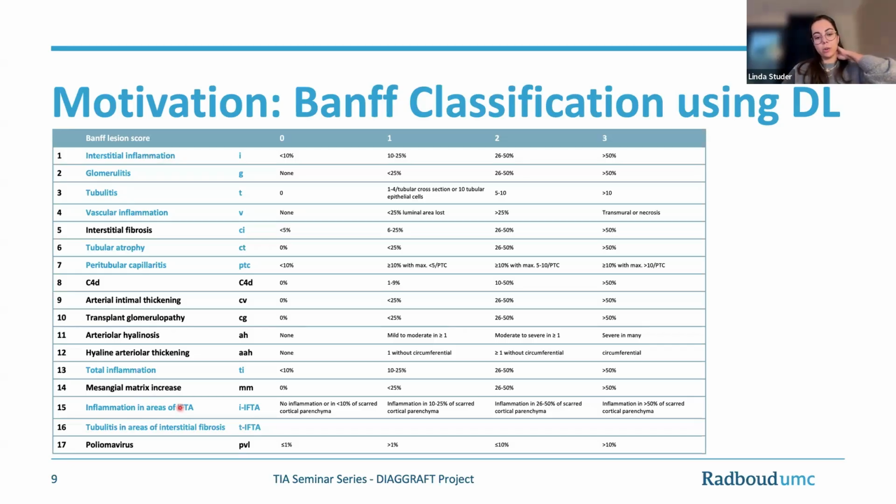So what we're working on now: we're not really looking at automating any of the other things, except maybe having a combined segmentation model and not these two separate ones. We're rather looking at seeing how it could work in diagnostics. But what we also want to do, and we're definitely working on it for the paper on the reader study, is to have an automatically computed Banff score. So we are working on getting the individual objects and being able to count the number of lymphocytes, the number of inflammatory cells within them, so that we can have a comparison.